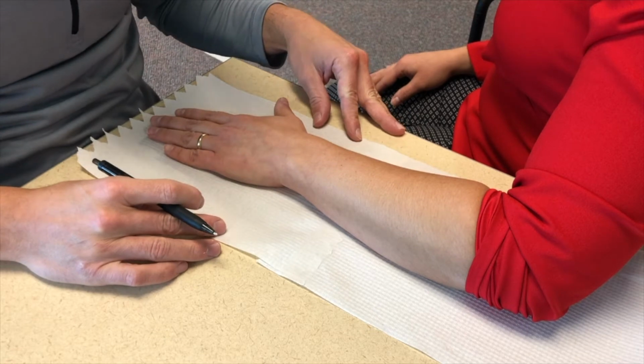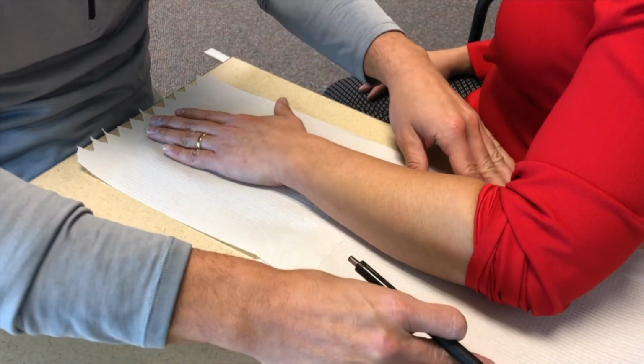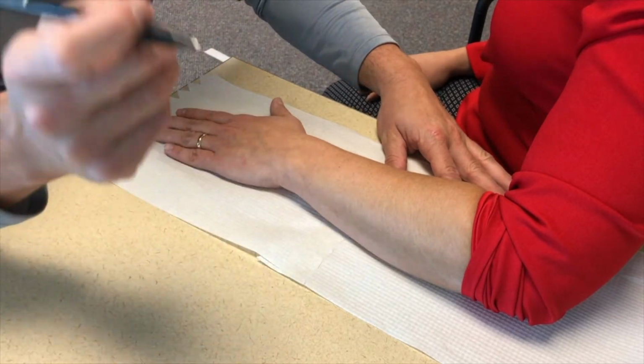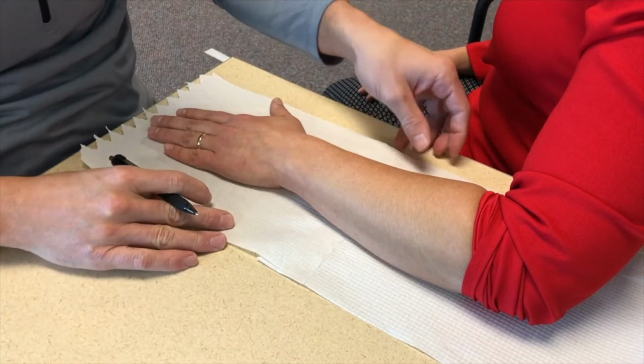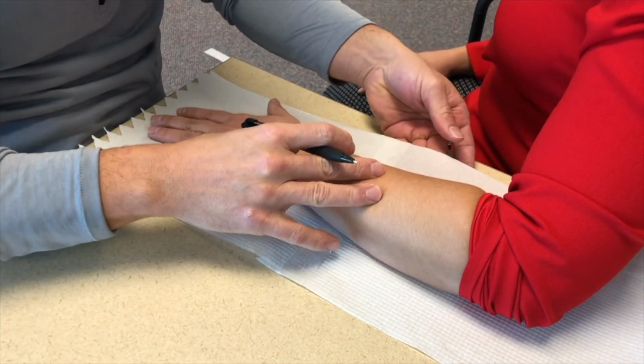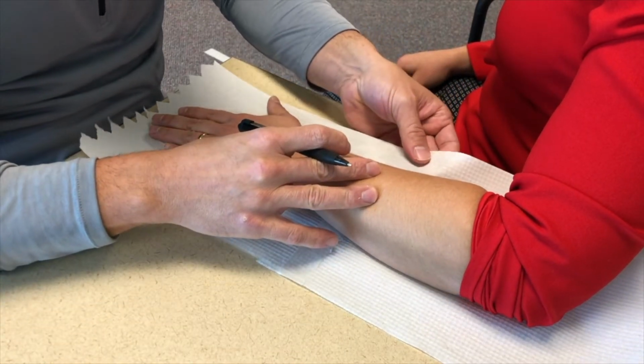Wrist cock-up splint. You're going to lay a paper towel beneath the client's hand and forearm, and draw a pattern of the splint onto the paper towel before you draw it onto your thermoplastic. So again, remember your splinting principles.